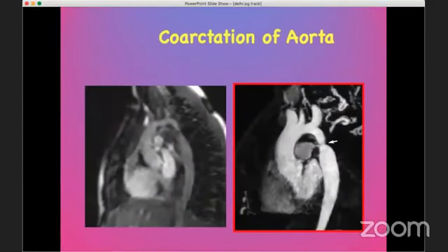Cardiac MR is also good for assessing extra cardiac structures. And one of the important areas that we look at is the coarctation of aorta, which can be sometimes challenging on echo due to window issues, and also because of aligning the Doppler along the stenosis. So in cardiac MR, we not only look at the stenosis severity and the location, but we also do a flow analysis at the diaphragm level and at a point 1 centimeter below the actual lesion.